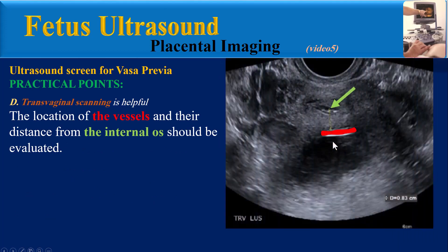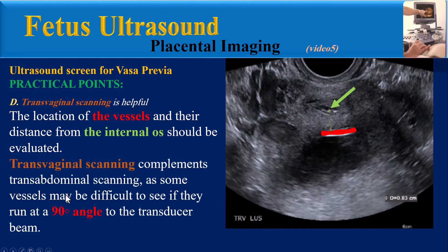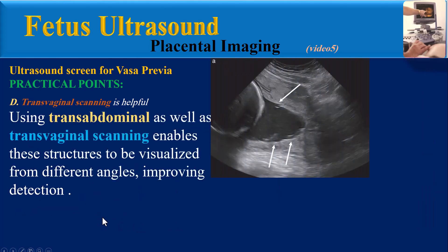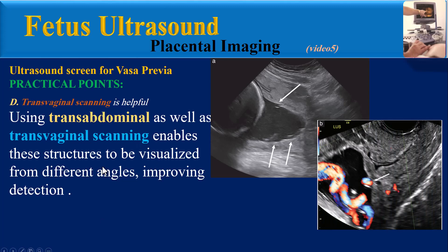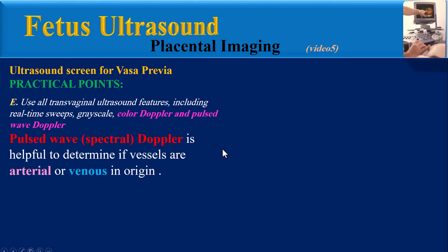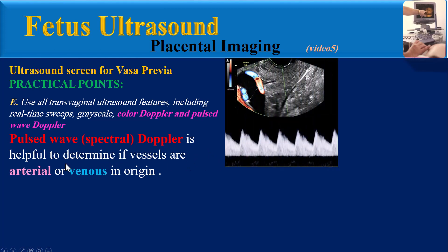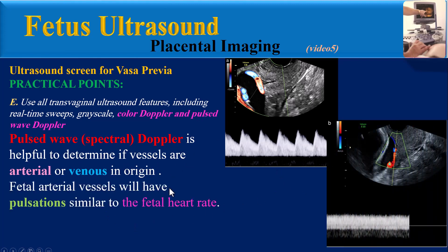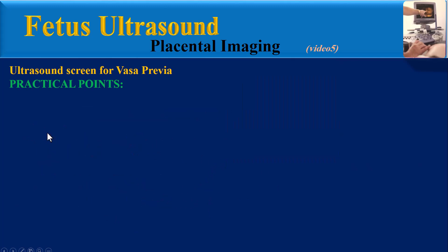The location of the vessels and their distance from the internal os should be evaluated. Transvaginal scanning complements transabdominal scanning, as vessels may be difficult to see if they run at a 90-degree angle to the transducer beam. Using transabdominal as well as transvaginal scanning enables structures to be visualized from different angles, improving detection. Use all transvaginal ultrasound features including real-time sweeps, grayscale, color, and pulsed wave Doppler. Pulsed wave Doppler is helpful to determine if vessels are arterial or venous; fetal arterial vessels will have pulsation similar to the fetal heart rate.